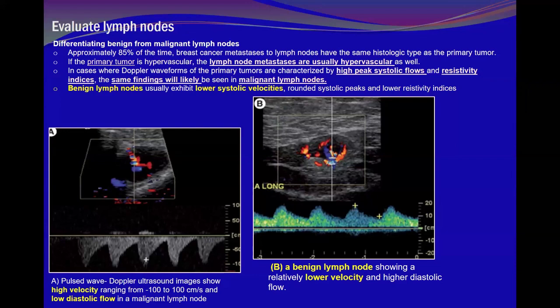And that is why this peak is repeated, and the repetition is so frequent. The frequency is high also, because of the high resistance. Yes, and the peak systolic flow velocity is reached in less time, while you can see in the other graph, the peak systolic flow velocity is reached at a much later time.